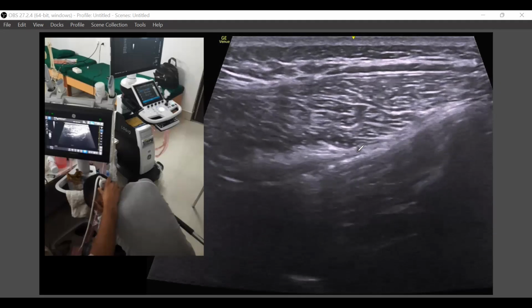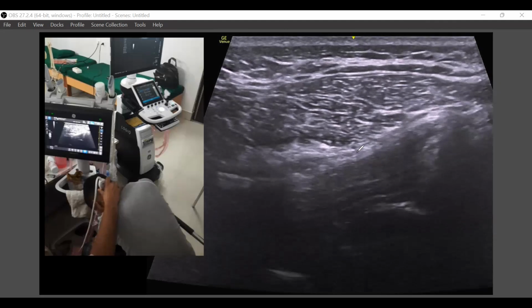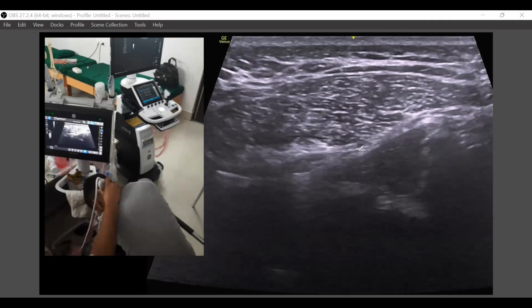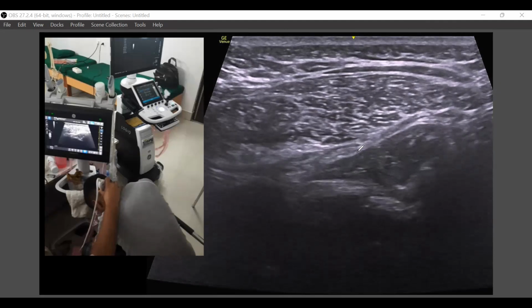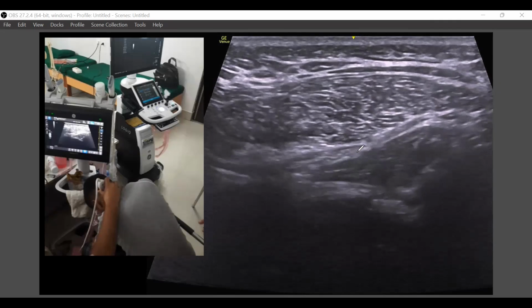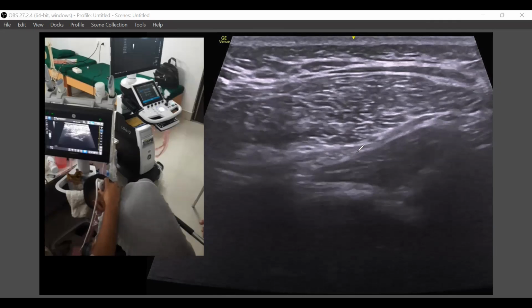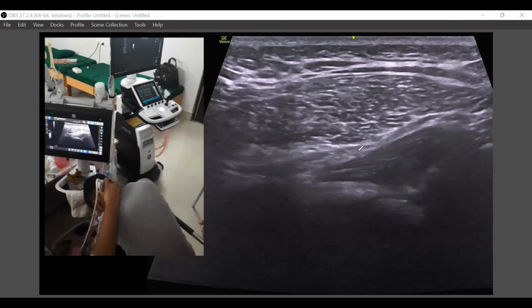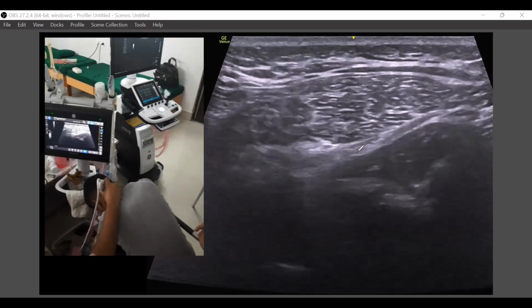nerve in the long axis as well. You see the greater occipital nerve, look at how I'm tilting the probe. I'm just making it opposite, and you'll be able to see the long line. See now this long line, and I'm just again tilting the probe. You see it is going medially, laterally. So this is your, and if I'm freezing it here, look at my probe position here.